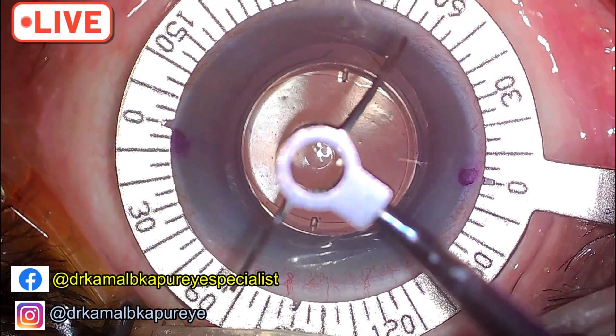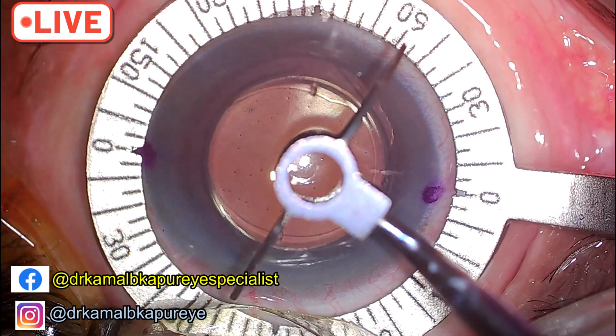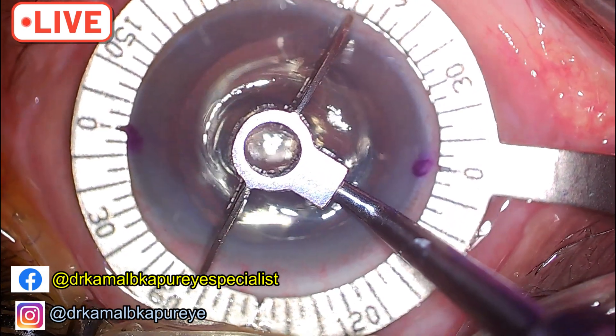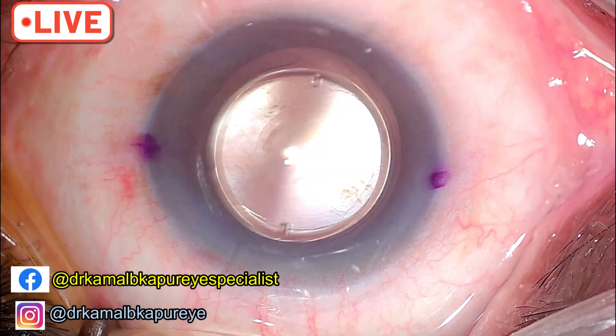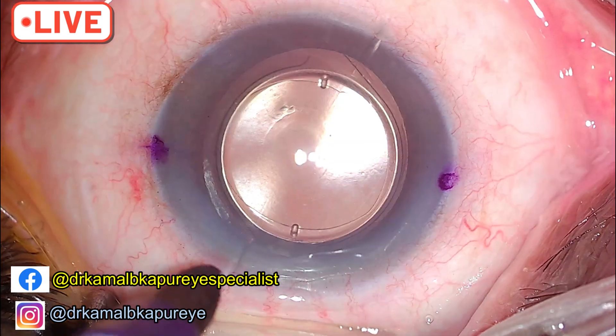I need to look at the central corneal Purkinje reflex. The two marks of 0 and 180 which were already marked — I will now reinforce these marks with my toric marker.